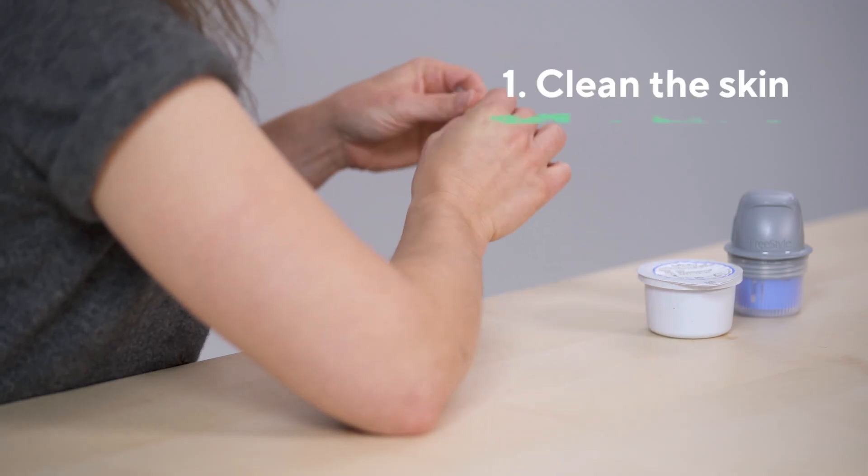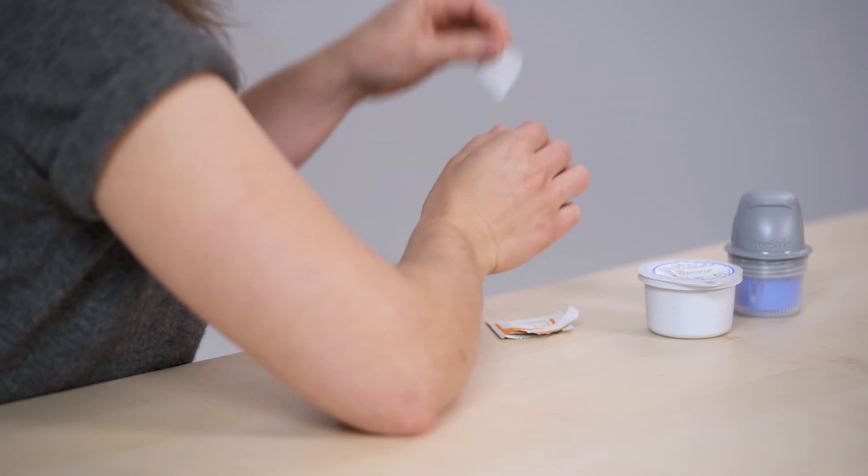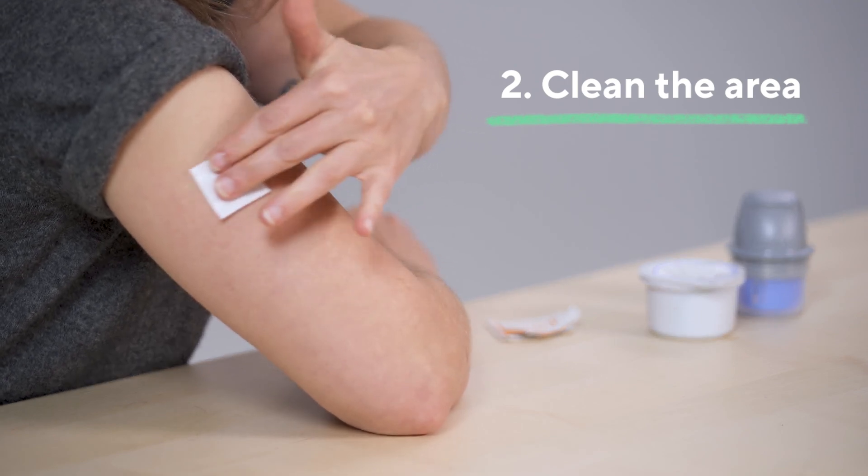All you have to do is: first, clean the skin where the CGM will be placed by washing with soap and water. Then, clean the area with an alcohol wipe to remove oily residue.